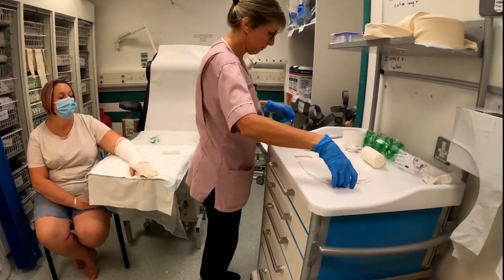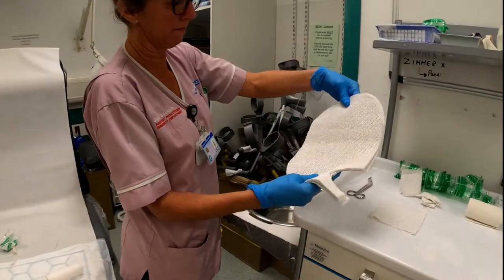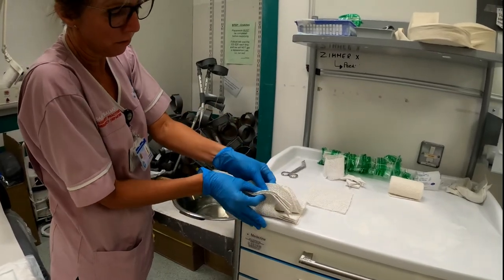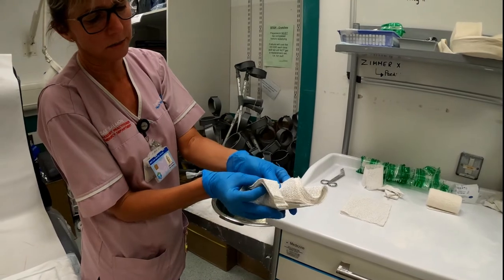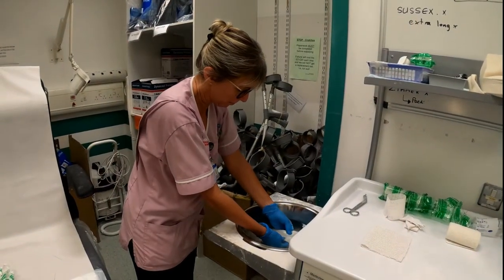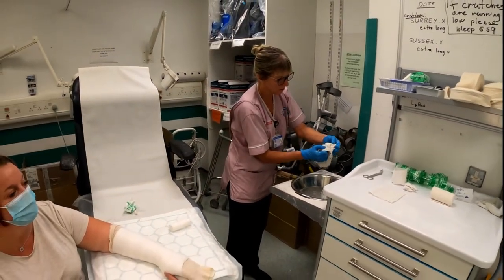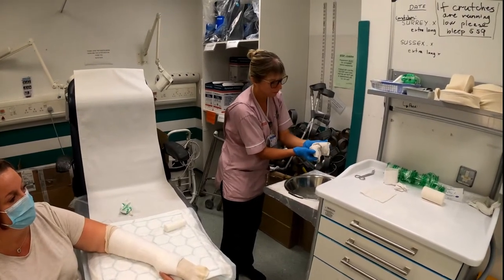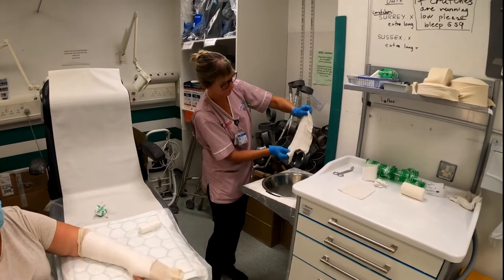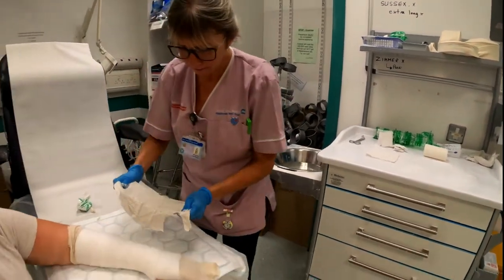We have some lukewarm water prepared. Fold the slab like a book shape with all your fingers behind and only the thumb and index holding the ends of the plaster so that you're in full control when you open it back out. Put it into the water, let all the bubbles disperse, take it out, and do a little squeeze at the top and a little squeeze at the bottom — not through the middle — so it's still wet enough and gives you time to apply without it drying out too quickly.